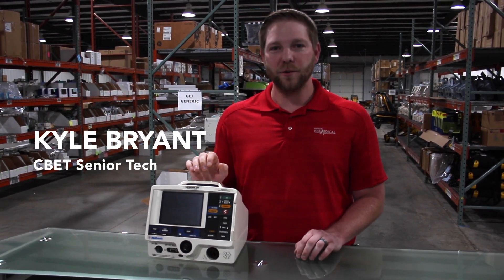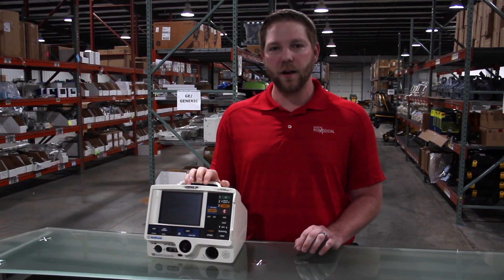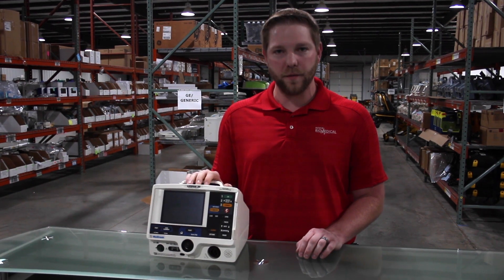Hey guys, this is Kyle with Renew Biomedical. Today I'm going to give you a quick demonstration on how to perform a PM on a LifePak 20 defibrillator.